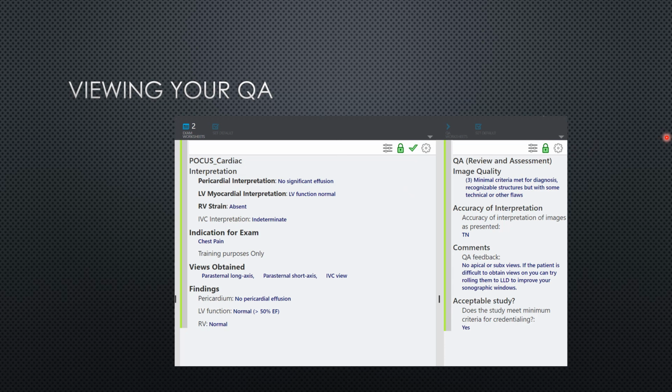If there is like some glaring error, I might have to say no. So like if there's a massive pericardial effusion, you say no effusion, then I'm probably going to have to say, well, no, you don't get credit for that because you missed this giant effusion, right? On the other hand, if there's a teeny tiny little effusion and you say no effusion, but the rest of your interpretation is pretty good, I'm probably going to give you credit for it. There's no hard and fast rule. That's just a general guideline.